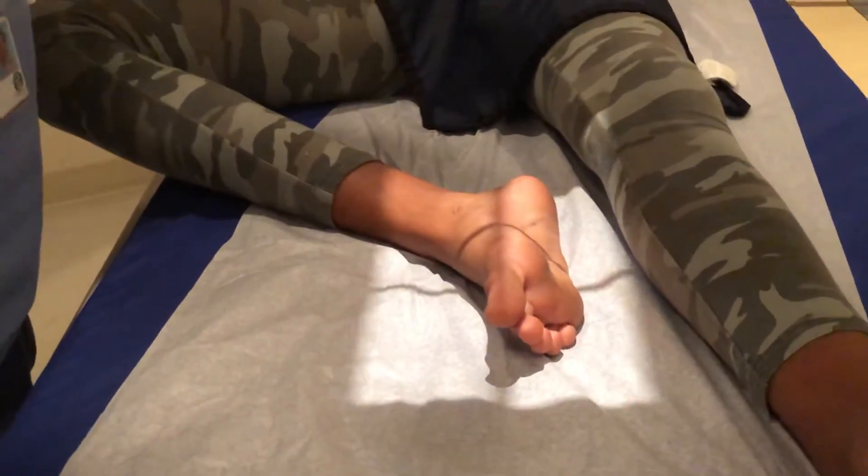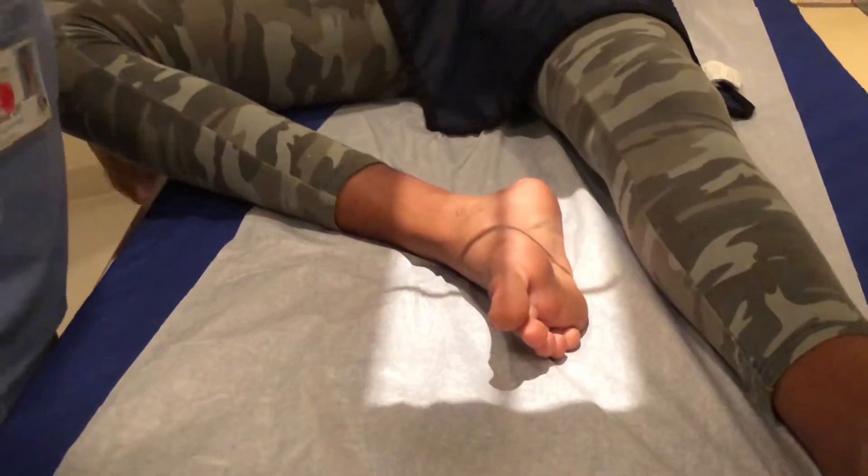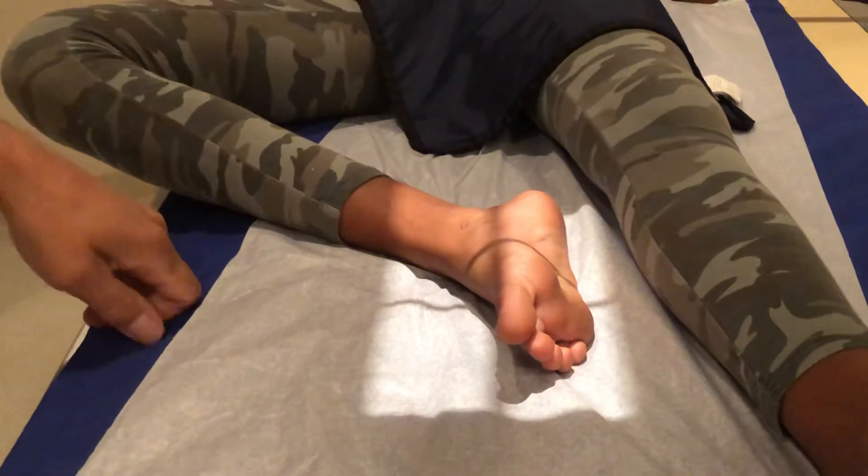You take the 10 degree angle off the tube and it's a straight beam. Center right in the foot — you do want to include the ankle there. And this is how you take a lateral x-ray of the foot.